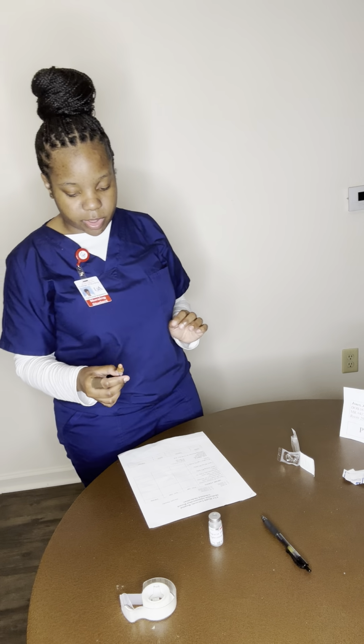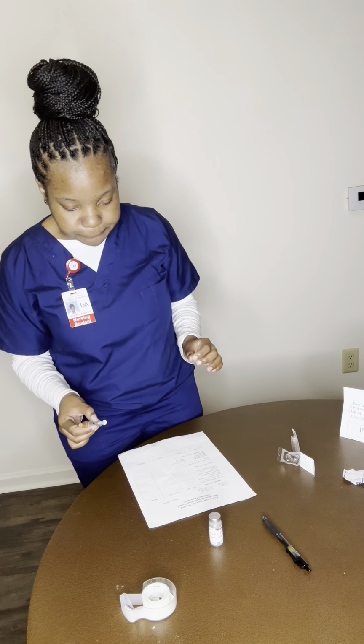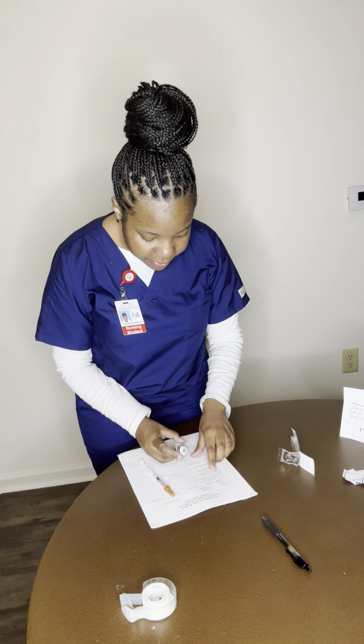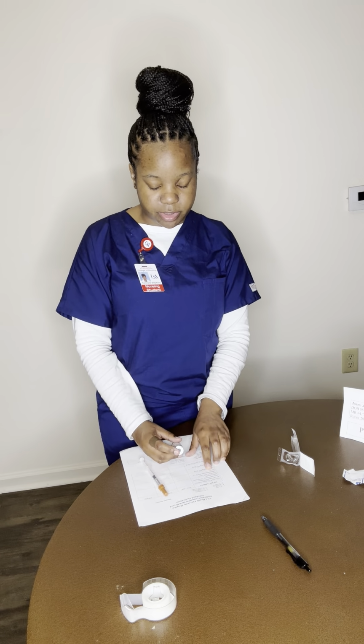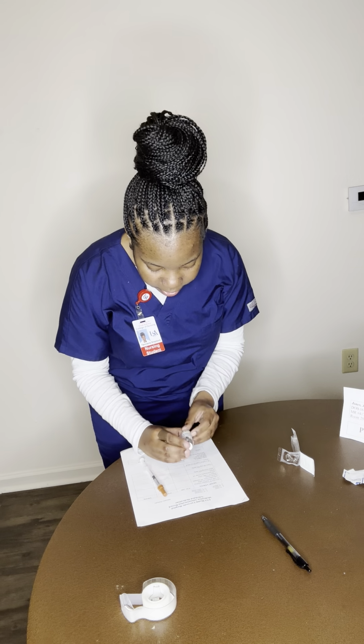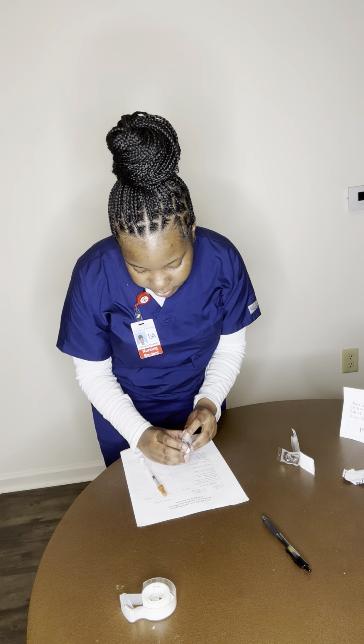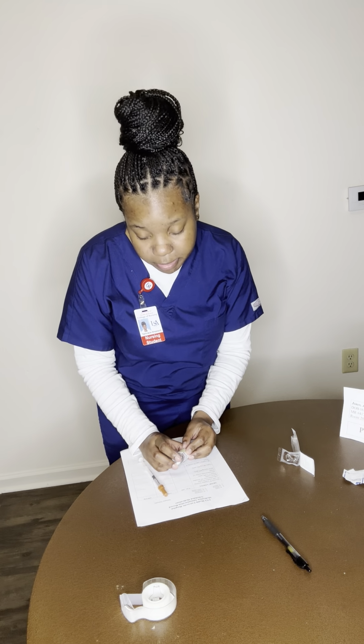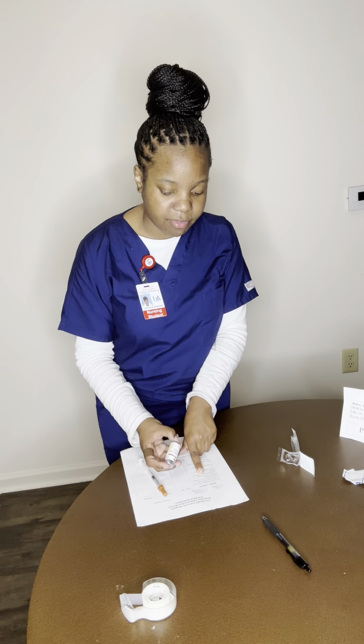So I am going to do a second check of accuracy. So it's heparin, 5,000 units subcutaneously every 12 hours. And the heparin is 10,000 units per milliliter. We know that 5,000 units is half of 10,000 units, so half of 1 milliliter would be 0.5 milliliters.